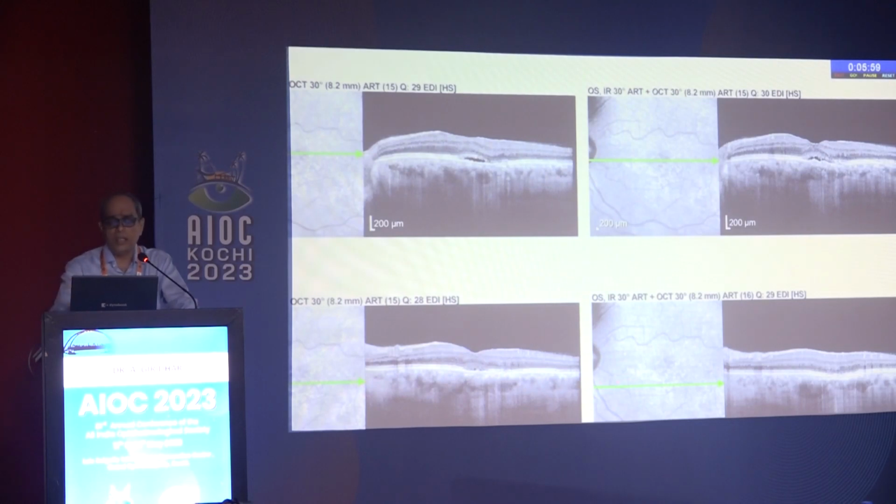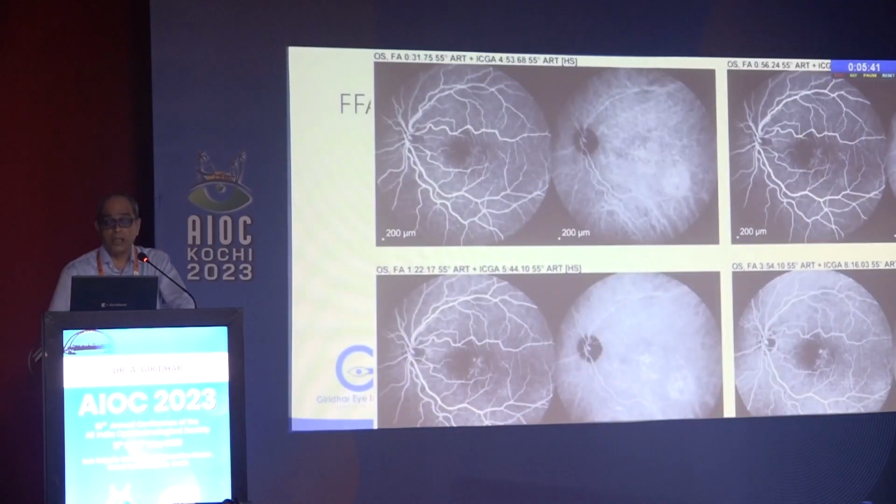In all sections you see, there is not much abnormality in the retinal pigment epithelium, no irregularity, very little. Serous macular detachment looks like a chronic case. Why is it chronic? You see the roof of the serous macular detachment, it is hyper-reflective. The roof of the serous macular detachment will be hyper-reflective and you will have multiple hyper-reflective dots within the serous macular detachment. Therefore, that means the fluid has been there for quite some time, okay?